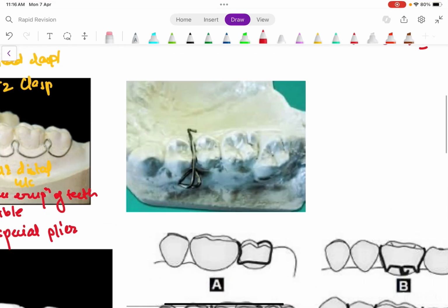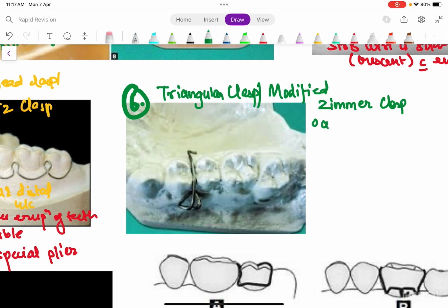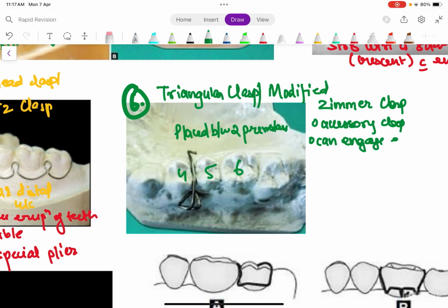Now let's talk about this one. So sixth, this is the triangular clasp. It is also called modified Zimmer clasp. Now this is an accessory clasp. Now see, this is 654. So this is placed between two premolars, can engage elastics, 0.7 mm stainless steel wire, open end is always placed distal.